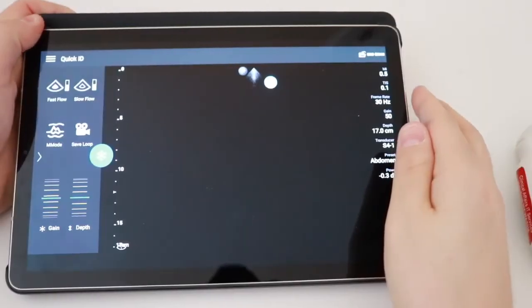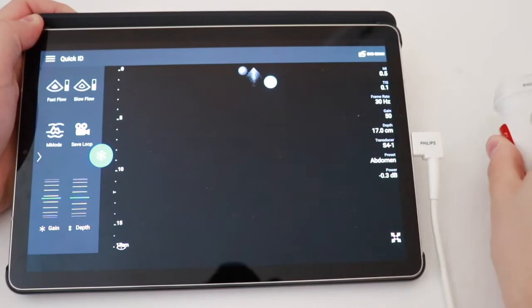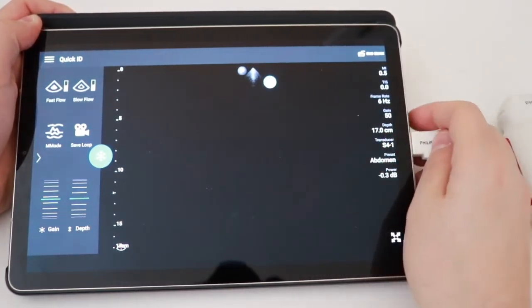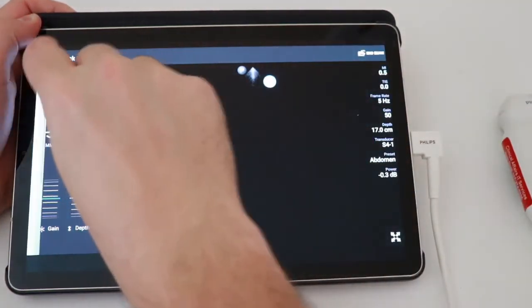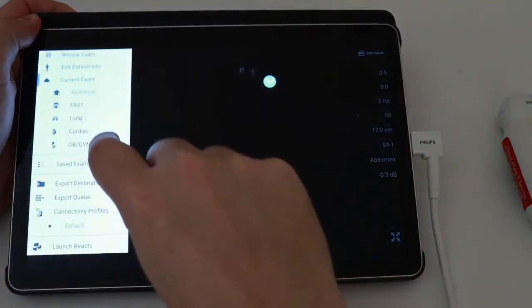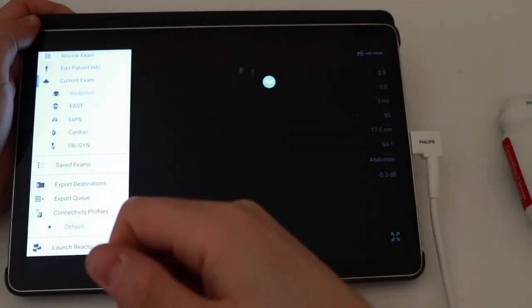We're going to start with the Philips Lumify. Philips Lumify has a probe that connects right here to the bottom. This is a standard phased arrayed probe, which means it works at low and mid frequencies. It makes it great at abdominal exams, cardiac exams, but not so good at nerve blocks, vascular access, or soft tissue sorts of purposes. If we want to change our exam, we go to this menu button over here, click that, and note I'm on abdomen right now. I can change over to fast, lung, cardiac, or OBGYN. Again, those sorts of exams that require a low frequency or deep structure sort of exam.